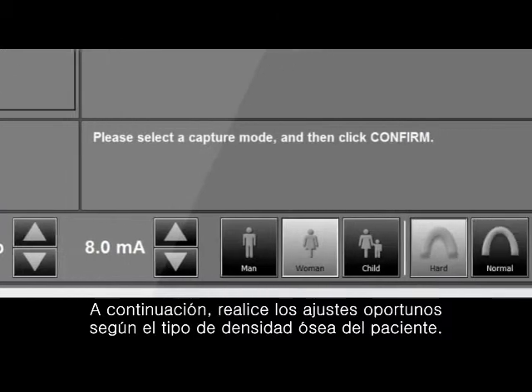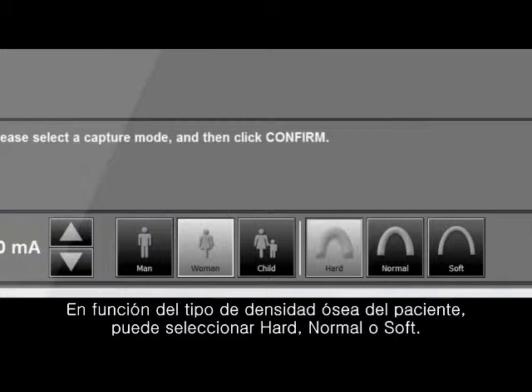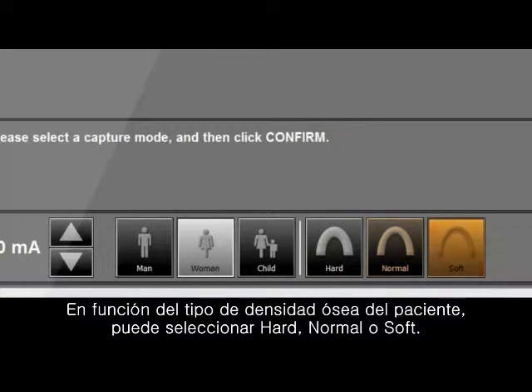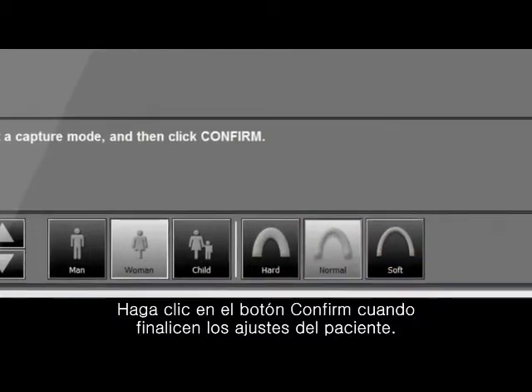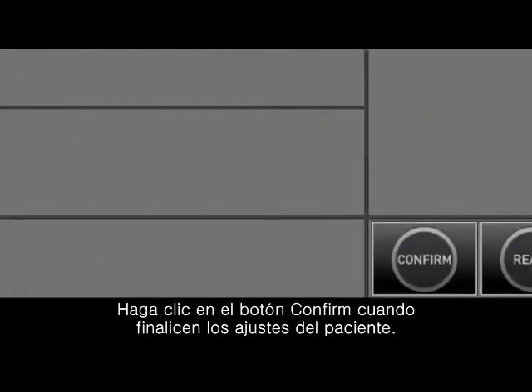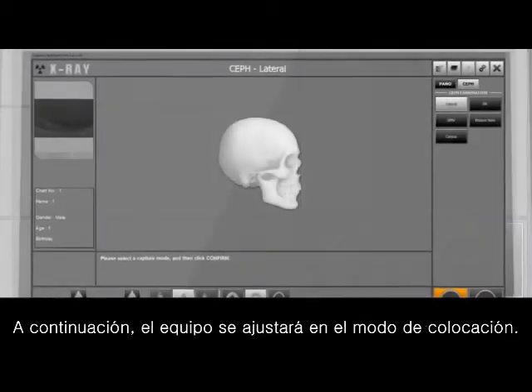Please do the appropriate setting for the patient's bone density type. Depending on the patient's bone density type, you can select hard, normal, or soft. Click the confirm button when the patient setting is completed.